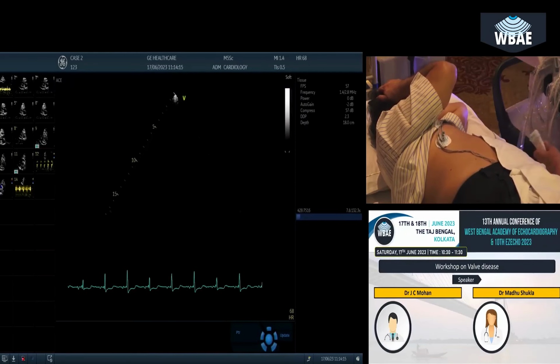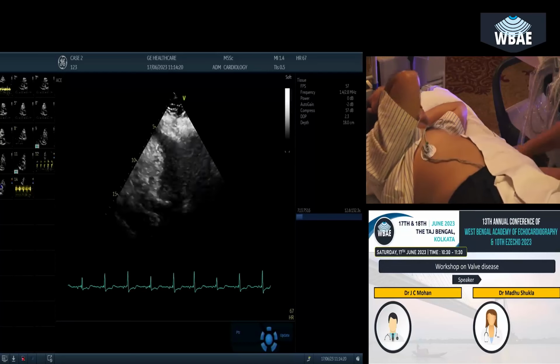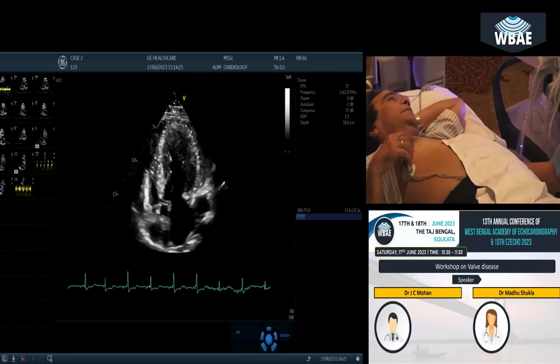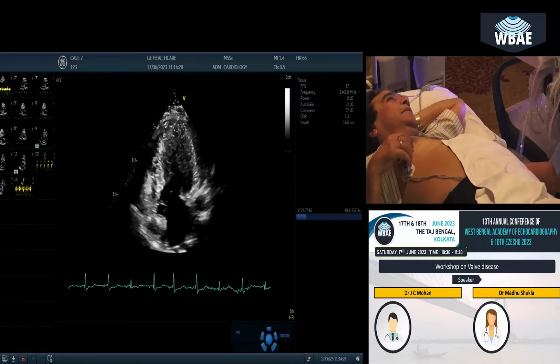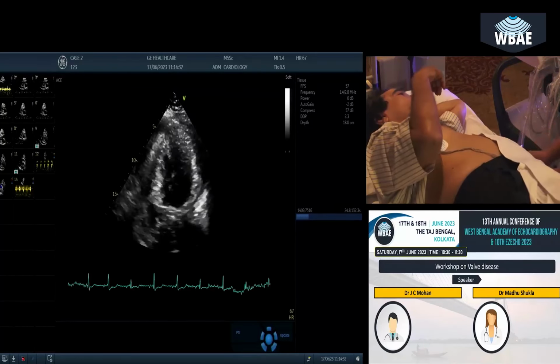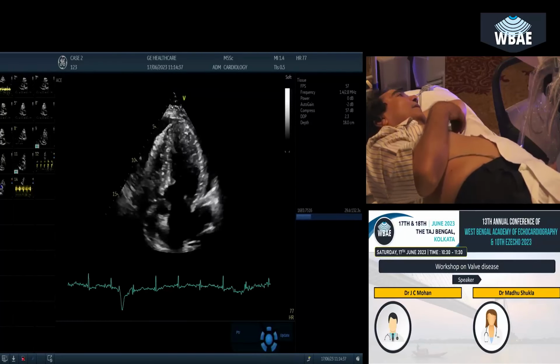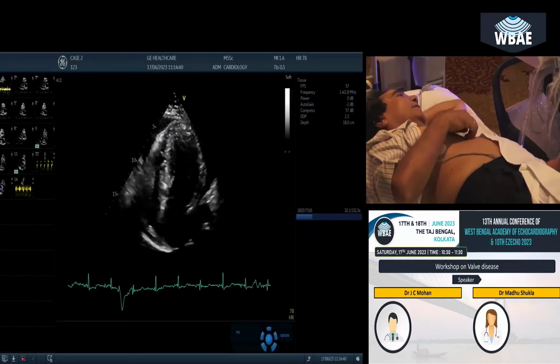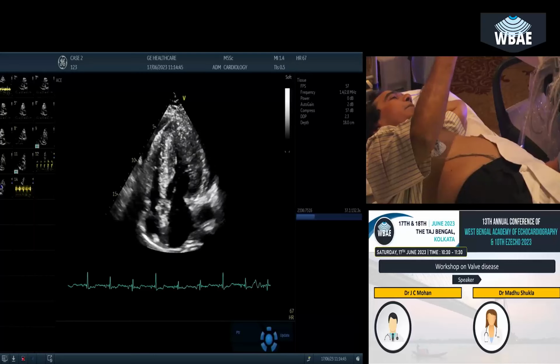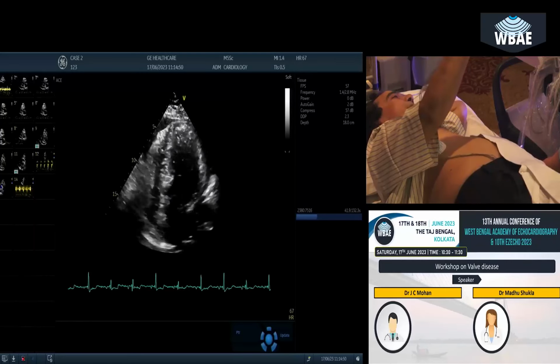We'll start with a 4-chamber, then 2-chamber, then a 5-chamber or 3-chamber. Another thought, by the time she gets the apical 4, do you measure the LV thickness in the short axis view? I always measure in short axis in all six segments, at all three levels. In fact, it has been suggested that the wall thickness in short axis is reliable except for the lateral wall, which is anisotropic; the other ones are very good.